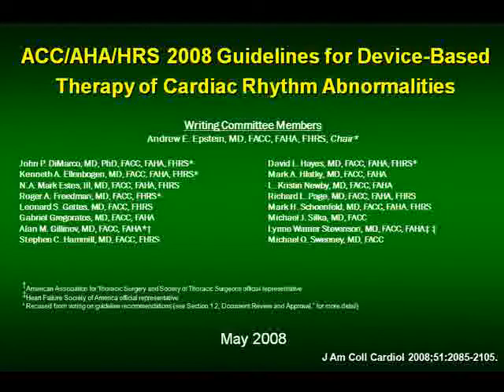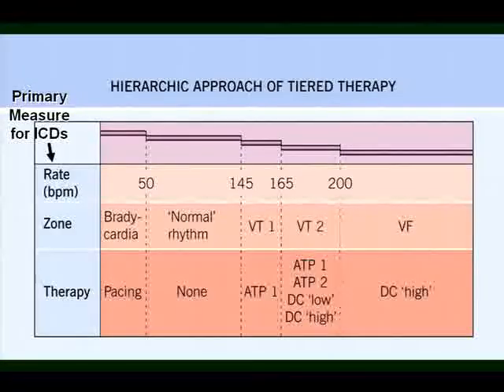The guidelines for this were published in 2008. Andy Epstein, who's now at Penn, was the leader of this group. It was a multidisciplinary group with people from both heart failure and cardiology, so it's a broadly based group. And if you're interested in the guidelines, it's a big issue now. Even as we go through healthcare reform, there's going to be a huge focus on defibrillators, and it's really a critical issue that you have to be comfortable with.